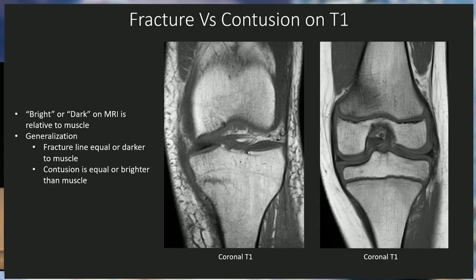So when we see that contusion pattern, we know there's likely been a transient lateral patellar dislocation event, and we're going to look for associated injuries. The medial patellofemoral ligament is the most important soft tissue stabilizer. Typically it lives under the vastus medialis obliquus. So we're going to go right to that image, usually on an axial or a sagittal, and look at that structure and see, is it torn?